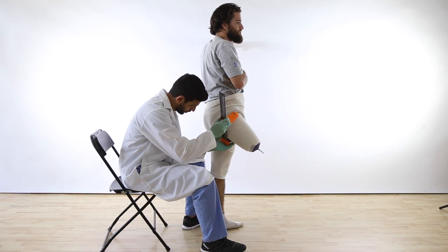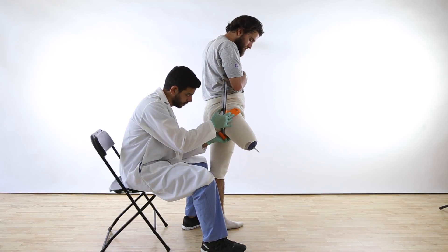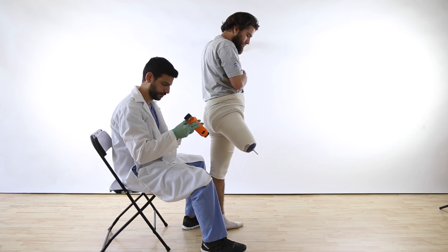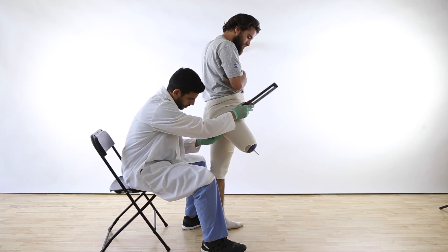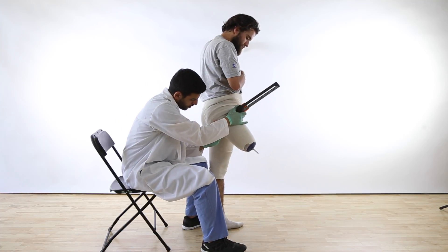Finally, using the same limb length gauge — by taking out the seat and turning it 180 degrees — it becomes an ML gauge. Use that to measure your AP and ML at the most proximal level on the patient's limb.